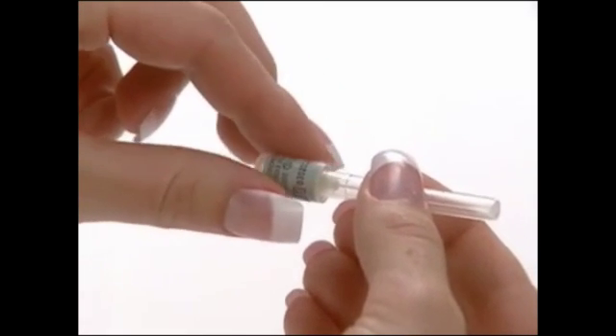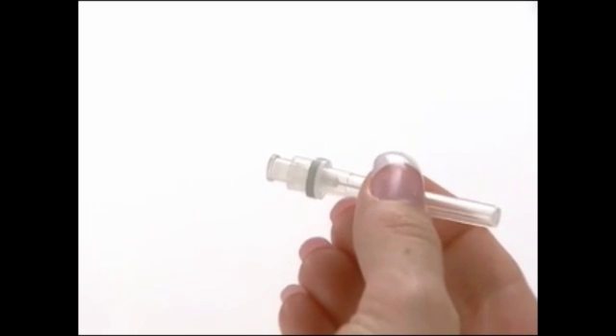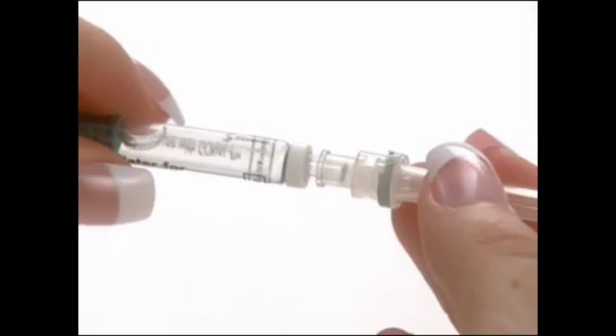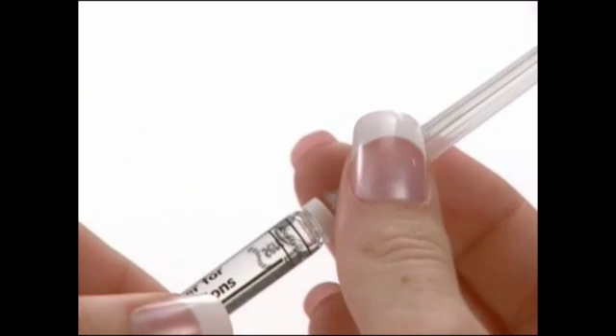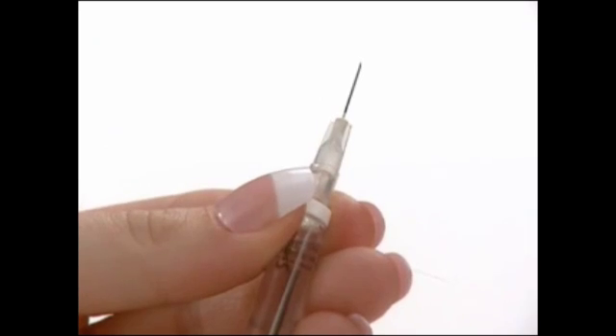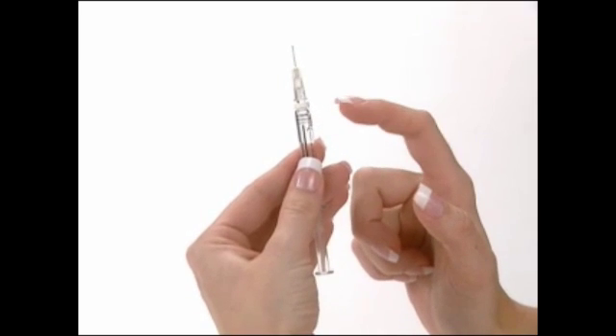Remove the safety seal cover from the 27 gauge, ½ inch gray needle. Push the needle onto the pre-filled syringe until it is tightened, being careful to keep the protective cap in place. Holding the hub or base of the needle, secure the needle on the tip of the pre-filled syringe and carefully remove the needle cap.